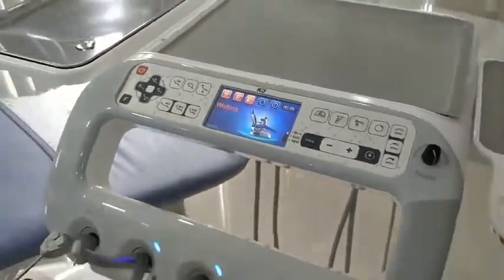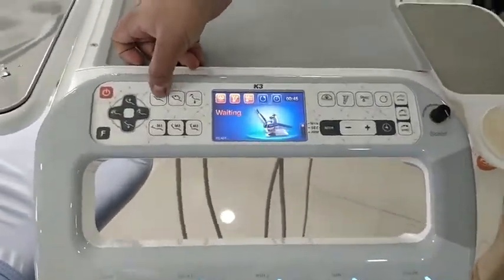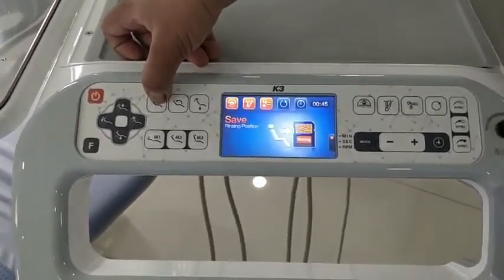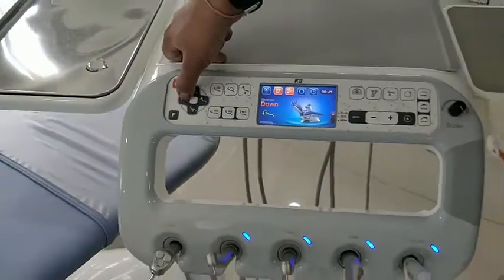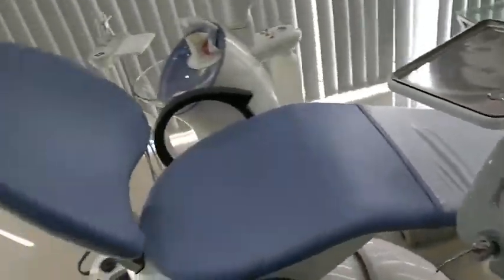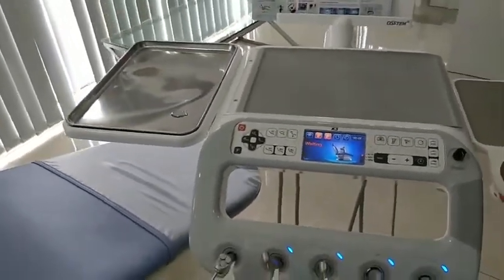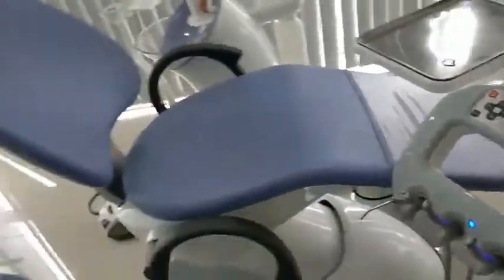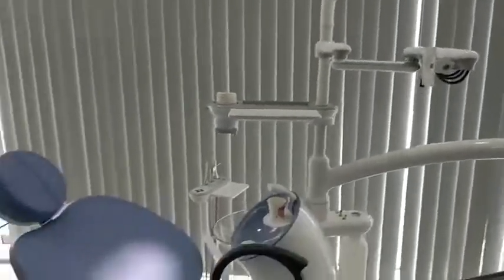The pre-set programs include a rinse or goggle position. When the patient is in a reclined position and you press this button, the chair comes to the goggle position so the patient can take a glass of water, gargle, and rinse.